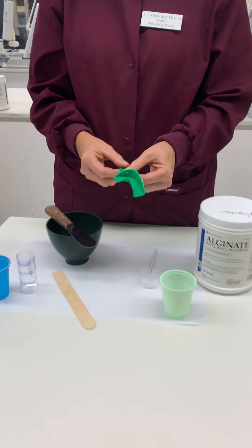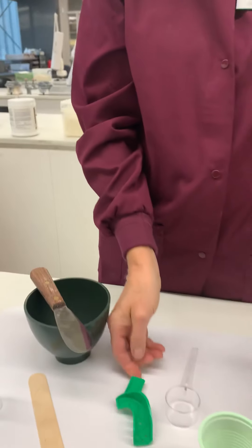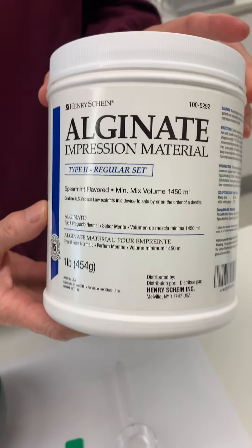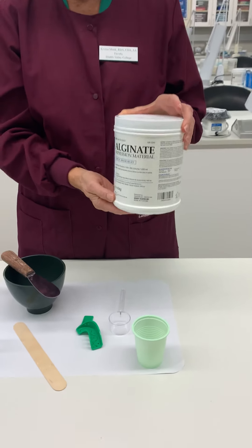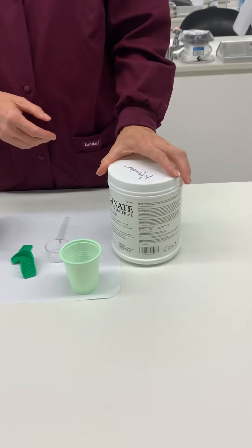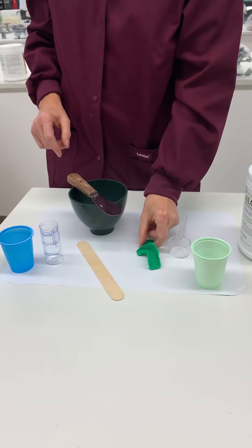We're going to be taking a quadrant alginate impression on our typodont using regular set alginate. The first thing we want to do is fluff the powder — we're going to go over one time, turn it back around, give it a couple of taps, and then let the dust settle.